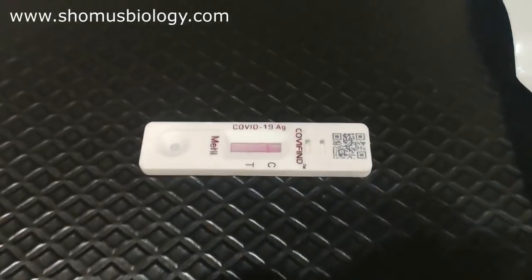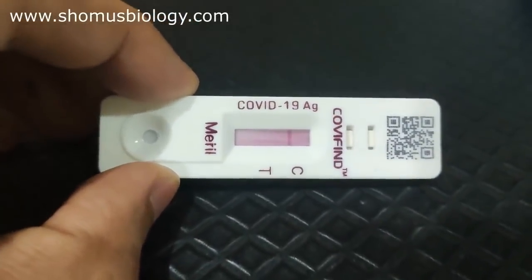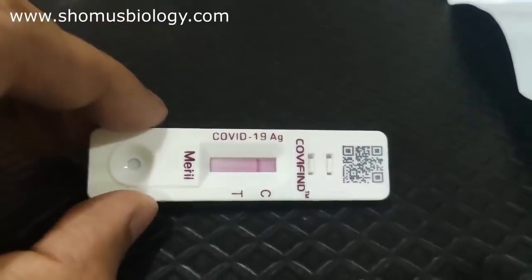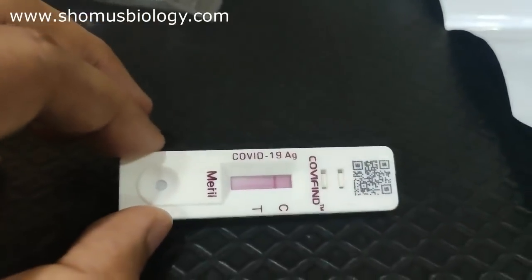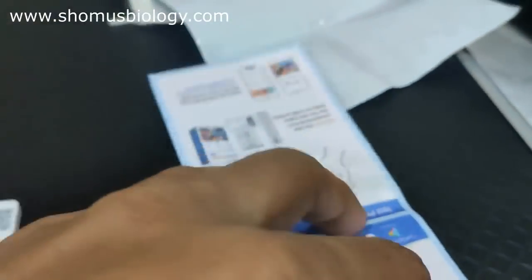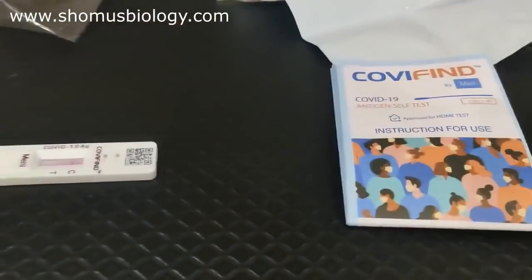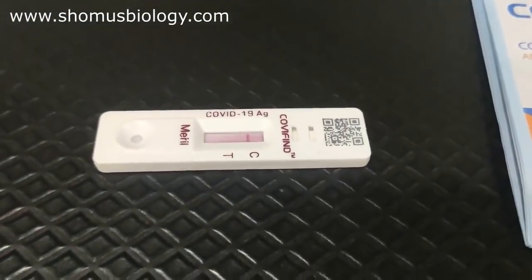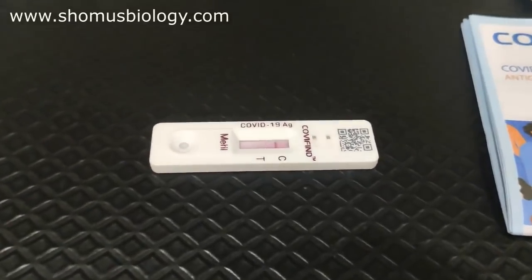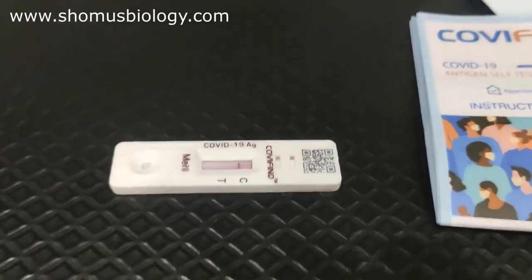The process is running — about six to seven minutes in, you can clearly see one distinct band at C (control) but no band at T, indicating a negative result. However, as per the instruction manual — which is quite large and thick with detailed pictorial representations — you must wait the full 15 minutes before reading the result. The timer continues in the Covifind app, and you cannot generate a report before 15 minutes.